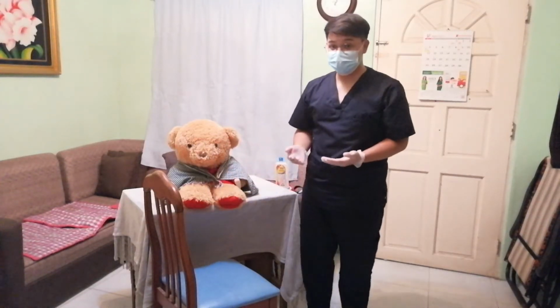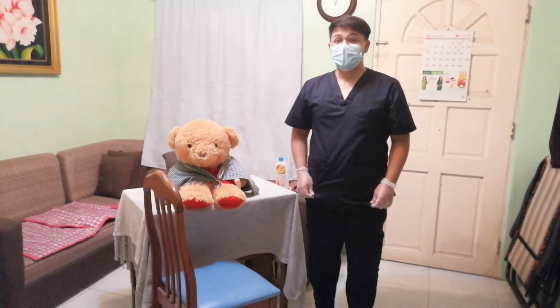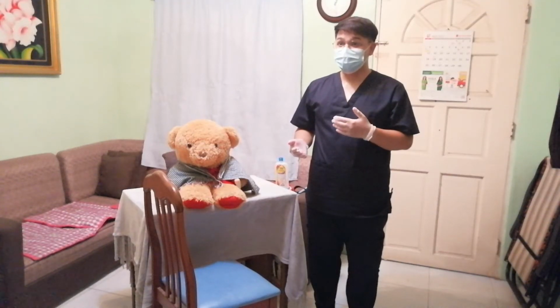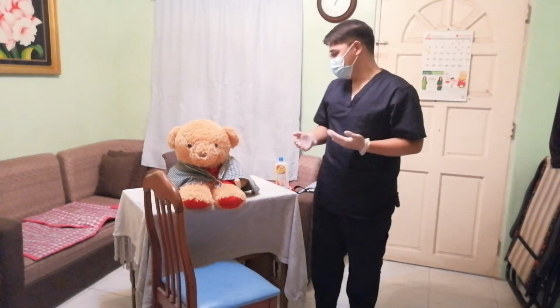So let us assume that the footwear has already been placed on the patient's foot. We will now proceed to our next step. We need to wrap the gait belt on the patient's waist. After that, it is based on assessment, as needed and facility policy.